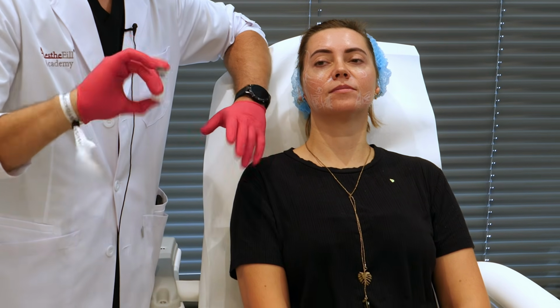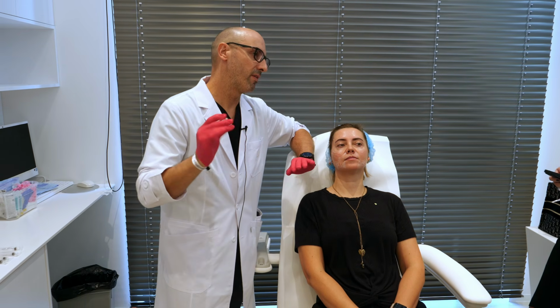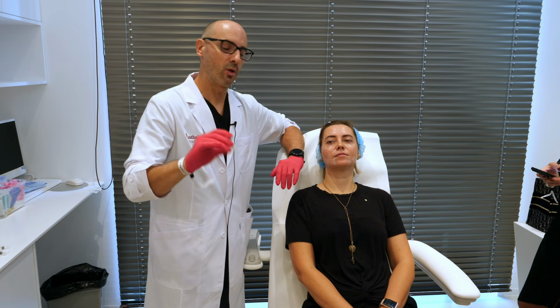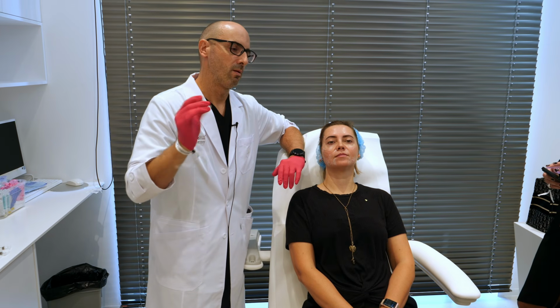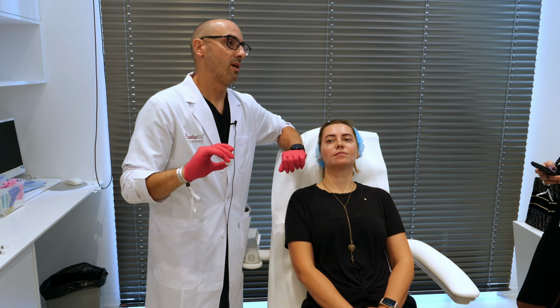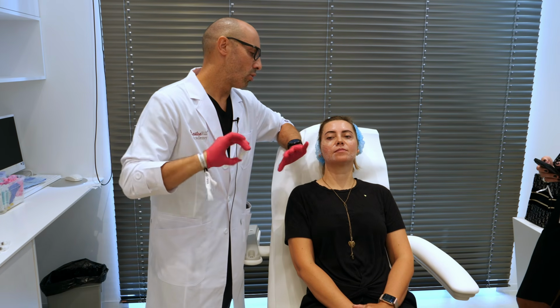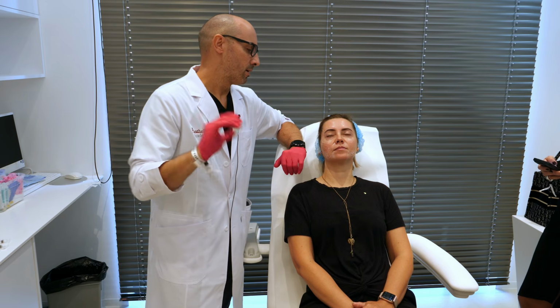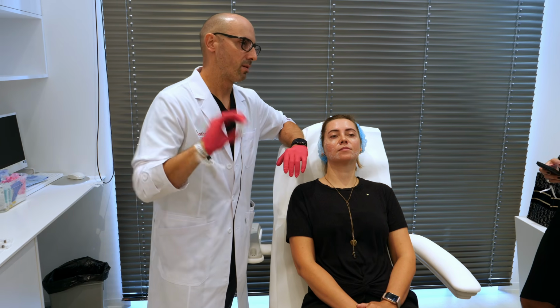The manufacturer says that 15 minutes is sufficient for the dilution. I prefer, if you can, 1 hour, okay? Because the hydration of the product is better. 15 minutes or 1 hour, it doesn't change the easy injection, it doesn't change the low inflammation in the patient, but in my opinion, you obtain a stronger effect, okay?